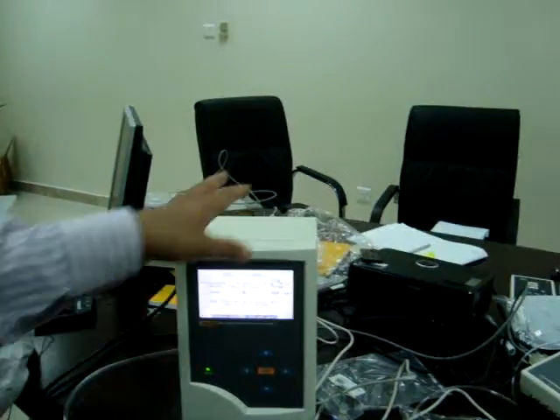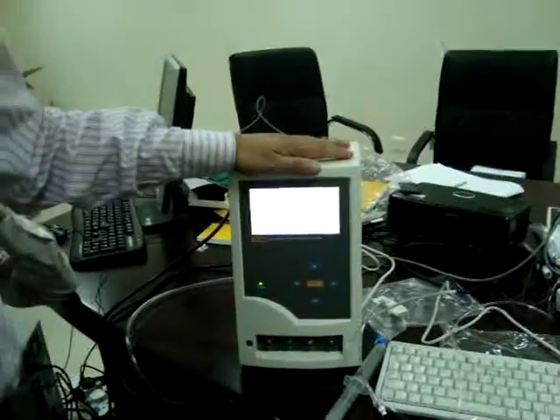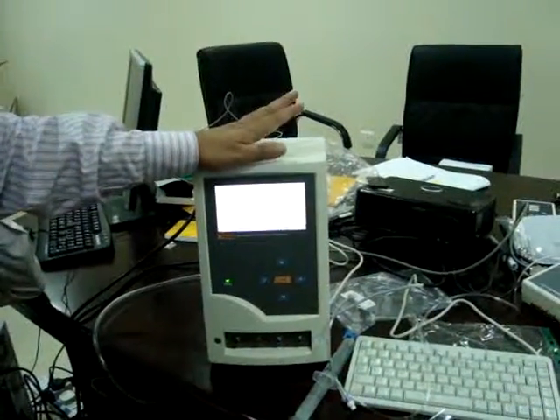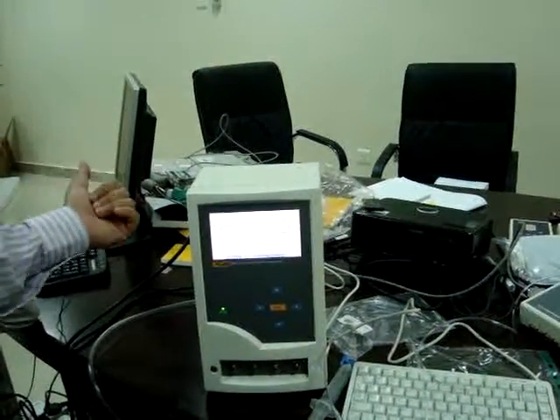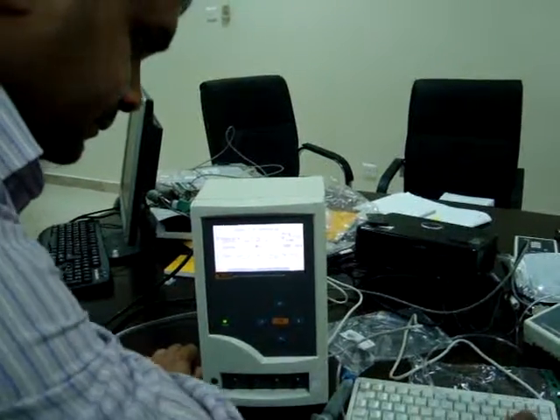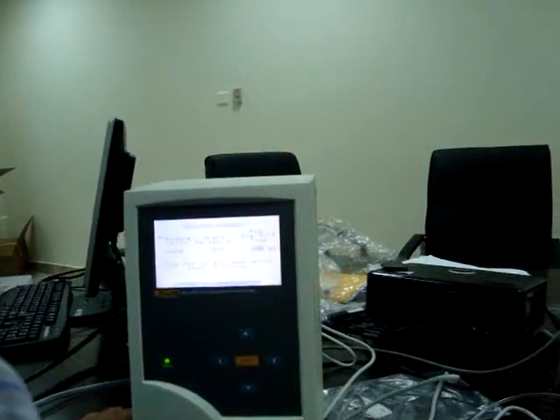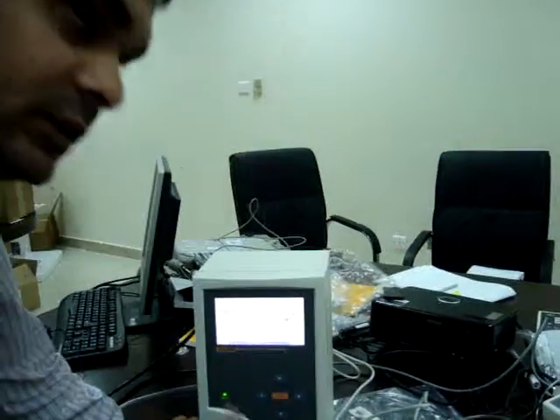Now graphs you cannot get on the printer directly or on the screen. You will get only numbers. If you want graphs, you have to use the software. Time. This is the time for the bolus. When you are giving a bolus, you have to decide the time.